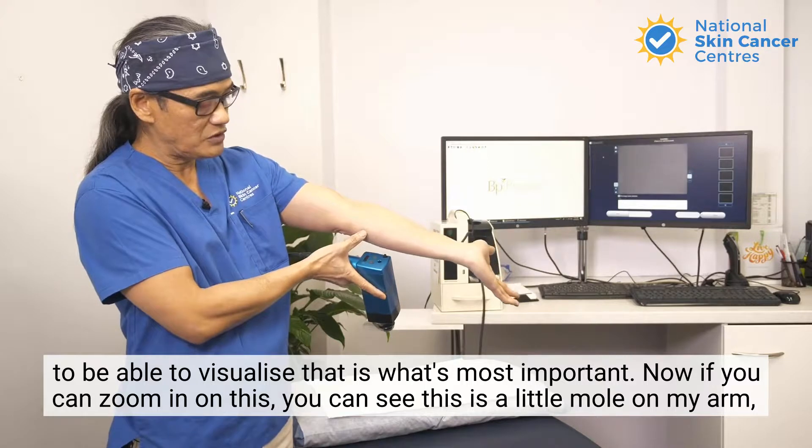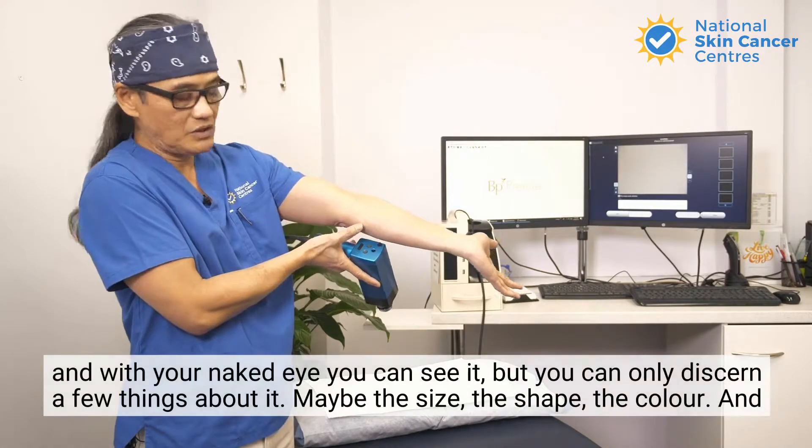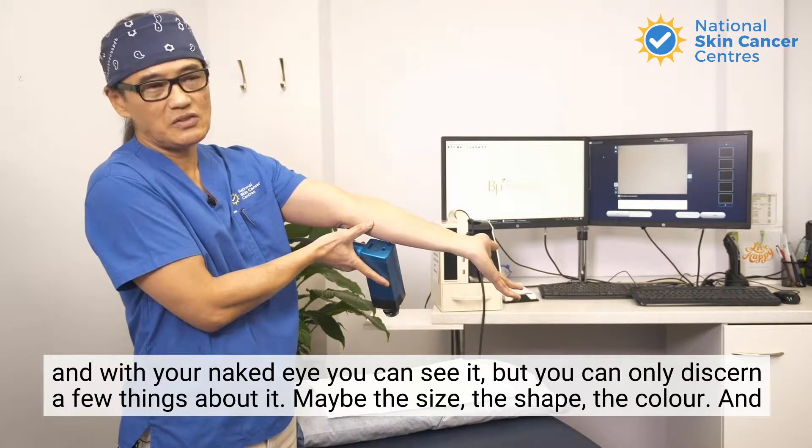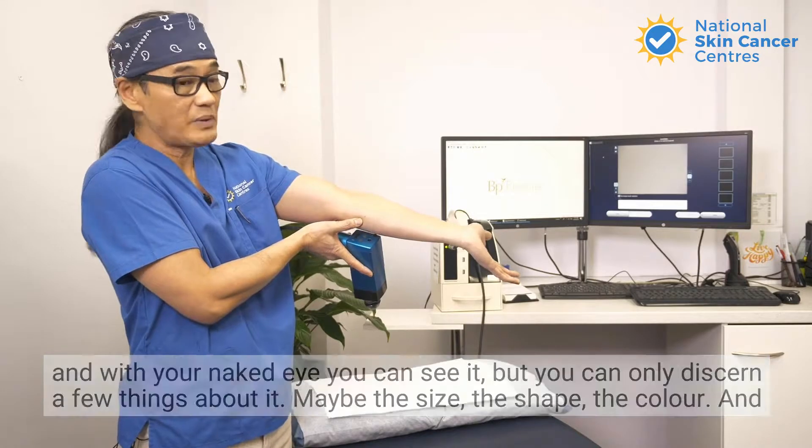Now if you can zoom in on this, you can see this is a little mole on my arm. With your naked eye you can see it, but you can only discern a few things about it — maybe the size, the shape, the color — and that's about it.